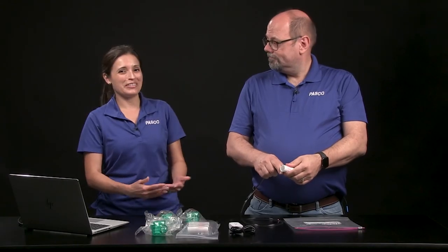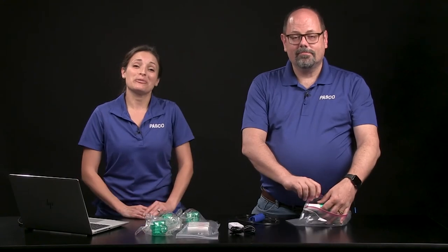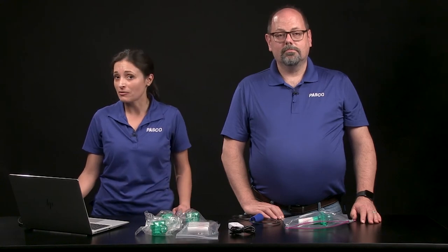It doesn't exactly feel natural to breathe through that filter, so you might want to go through several runs. Your results will look similar to this. It's okay if the two recovery breaths at the end look slightly offset compared to the initial breaths. In any case, avoid using those recovery breaths for analysis.